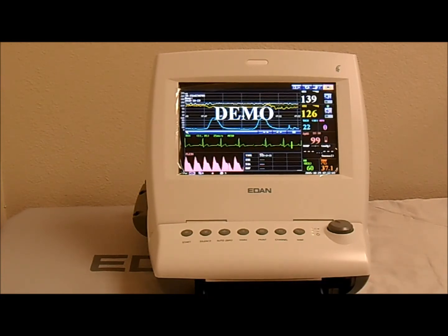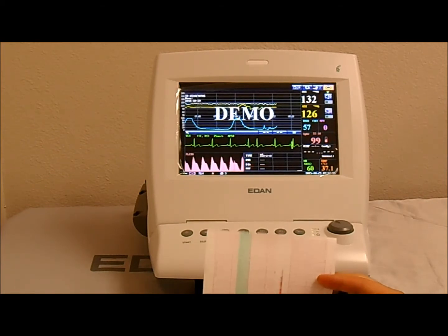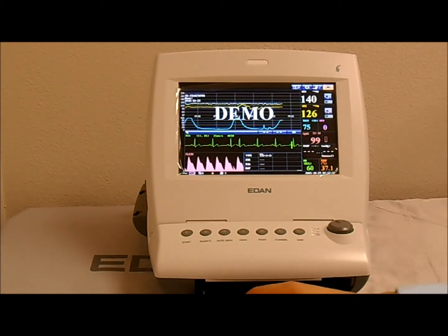Now, to load the paper, you want to make sure you have the grid facing up, and if you take a look at the opposite side, one of the sides is going to have a red marker. This is the indicator to assist the clinician in knowing that the paper is about to run out. So you want to make sure that you're loading the paper on the side that doesn't have that red marker.